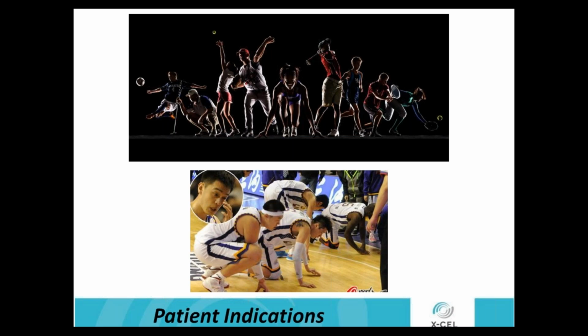If you think of an outdoor sport or even an indoor sport, that gives you the best possible visual acuity with the scleral lens. So I say all that to just say, make sure that you're looking at the broad picture. The big thing with normal corneas is trying to justify that cost to a normal cornea patient. And I think the easiest way to do that is the quality of life. You have to understand what they're looking for in the quality of life, and then you can put that into how the scleral is going to help that quality of life and show the value of that scleral to that patient.